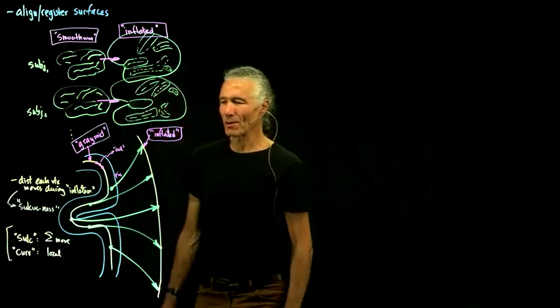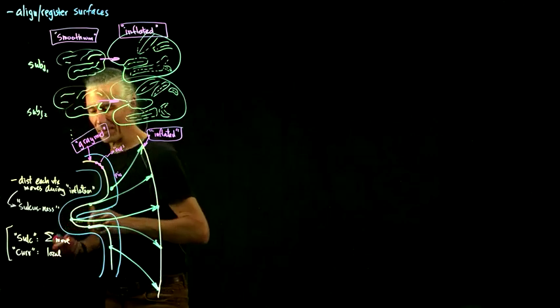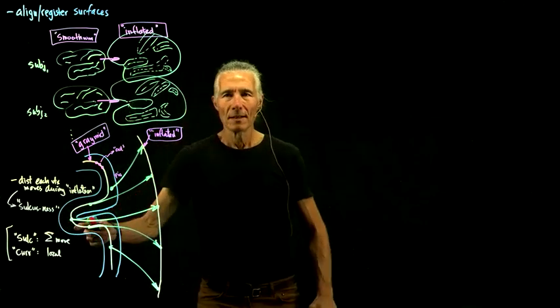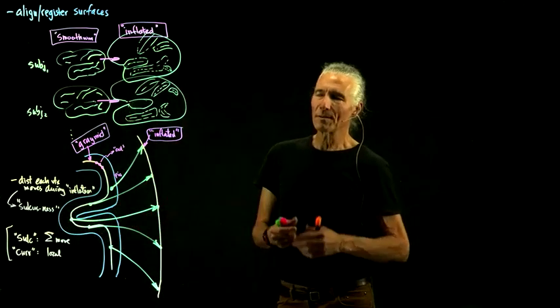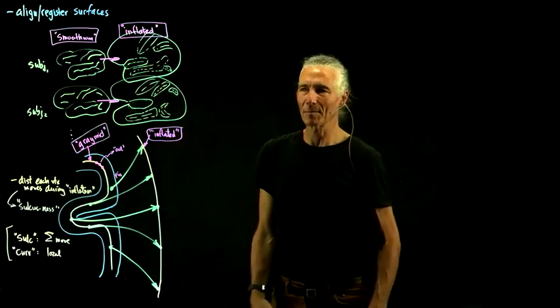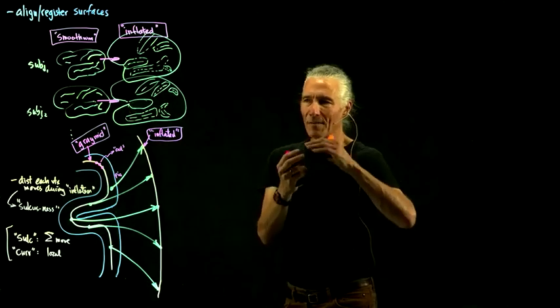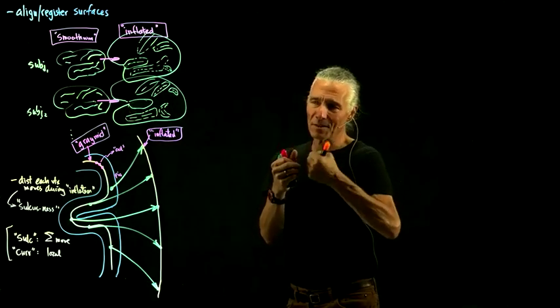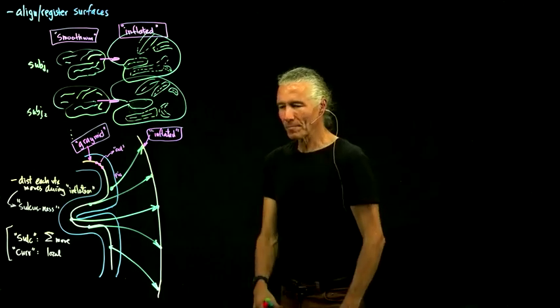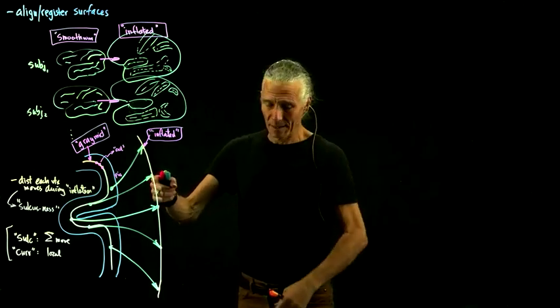If you just look at the total amount that each vertex moved, it gives you something that tells you how much like a sulcus something is. It has the advantage that if it's not a very deep sulcus, then it's not as strong a number. And so the idea was, let's use that to line up brains.